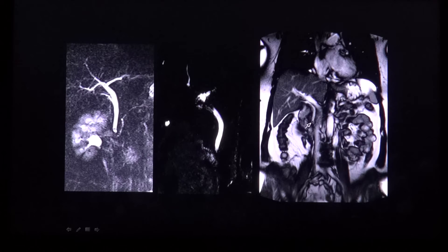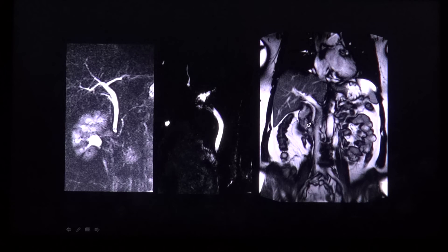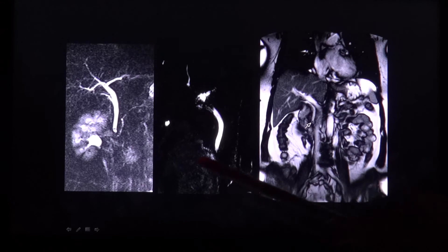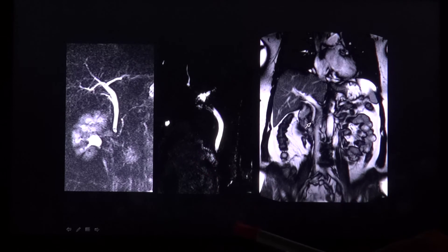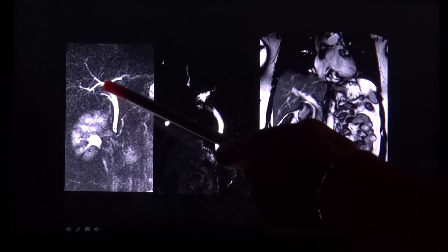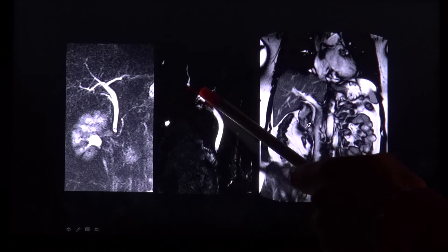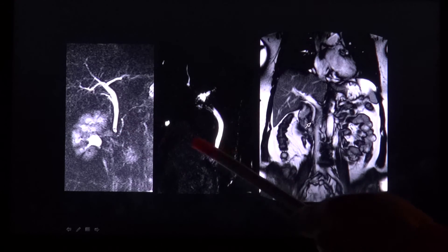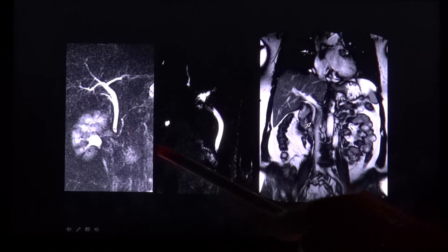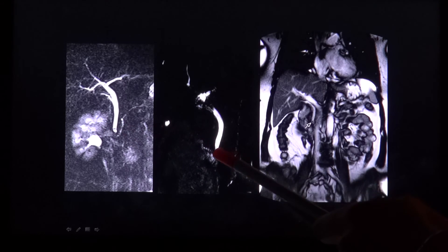Another method that manages without X-rays and contrast media is the MRCP, which stands for magnetic resonance cholangiopancreatography. The MRCP uses either a so-called RARE or HASTE technique, which both have a strong T2 character, as seen here. With this method you can see a low signal filling defect within the very bright signal of the bile — here a bright signal of the bile and this dot-like punctate low filling defect in the distal common bile duct, better seen on this image than here.